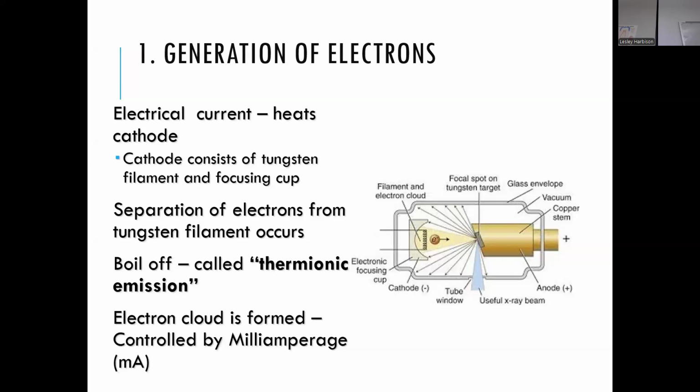The milliamperage control. Milliamperage controls the generating ability of electrons, or the generation of electrons. It controls the heating up of the tungsten filament and the fact that we even have electrons available, that whole process. And we do talk about an extra step, I think it's next week or the week after, which clarifies a little bit more about why MA controls this part of it, but we don't go too deep. But yeah, MA basically controls the energy needed to generate electrons.